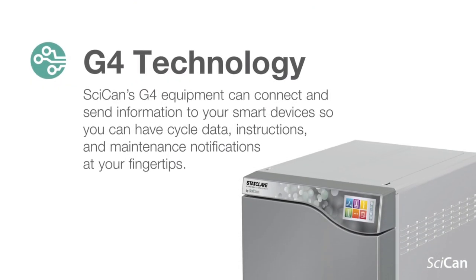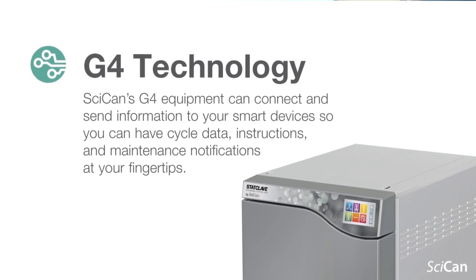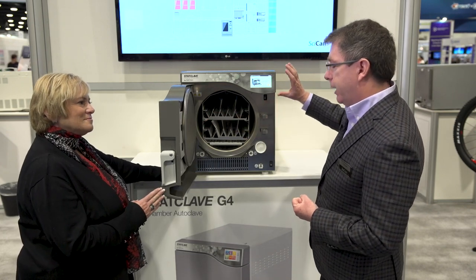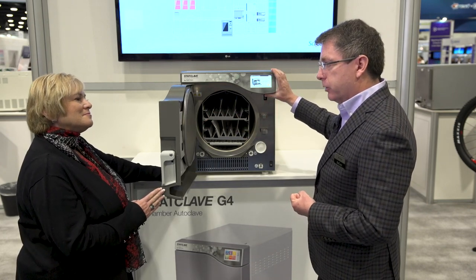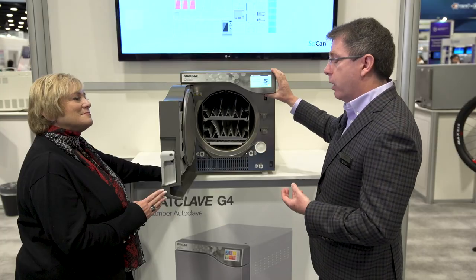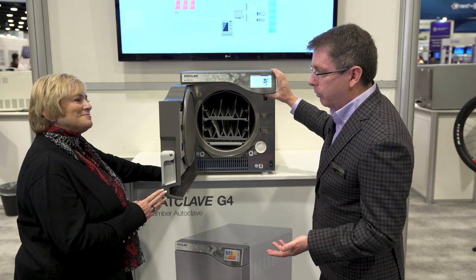We've developed a platform with our G4 technology, which gives it a lot of functionality. It will record all the cycle data onto a USB stick internally. There's also an SD card behind the screen, so it's duplicating the data there — making it almost impossible to lose the data. It will also email the data directly to SciCan and we will store it on our cloud for free. They could also create an optional free Gmail account and store all the data on another account.